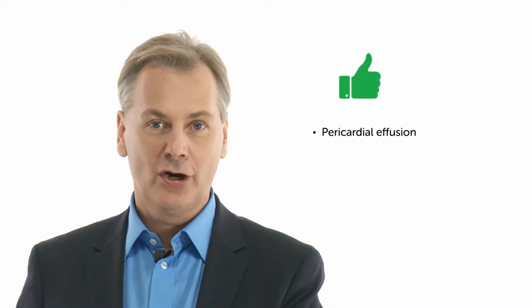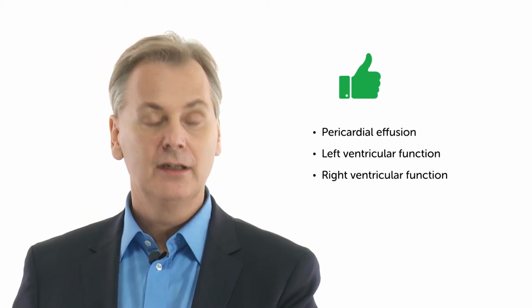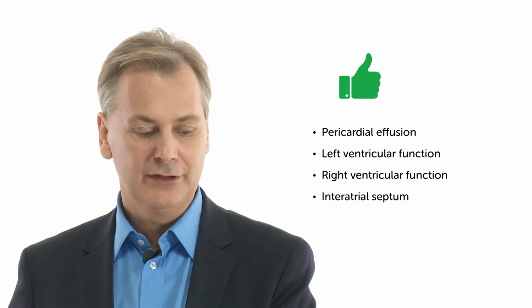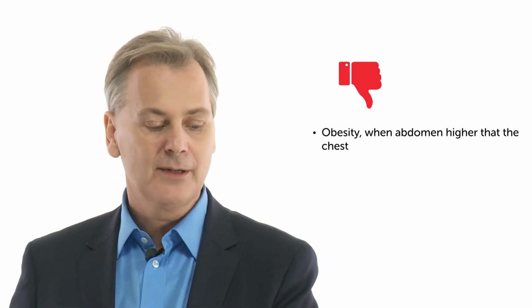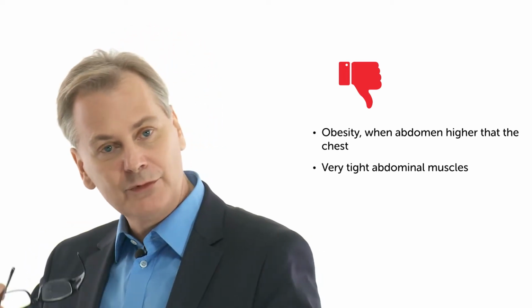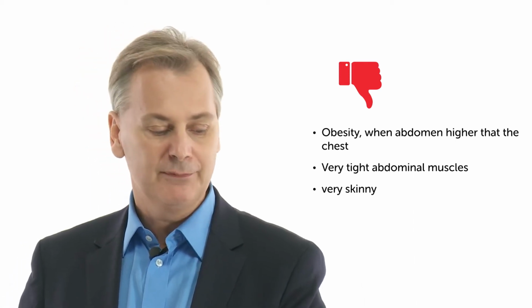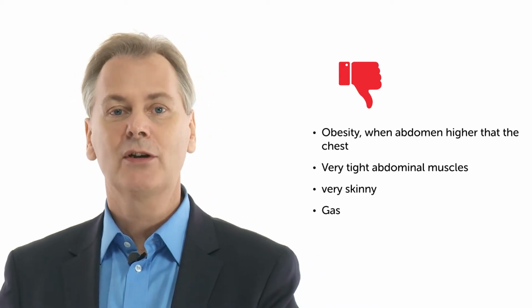One advantage of the subcostal view is that you can nicely detect pericardial effusions, that it's possible to look at left ventricular function and even right ventricular function, and that it is an optimal view to look at the interatrial septum. And the disadvantages? Patients who are very obese are sometimes very difficult to investigate from a subcostal position. Patients who have very tight abdominal muscles, you cannot really put the probe into their abdomen to get a good view. It might be very difficult if patients are very skinny. And finally, gas can be a problem, especially if you want to visualize the apex.